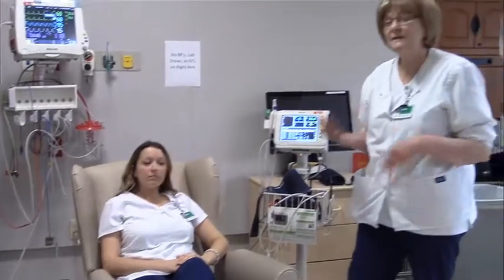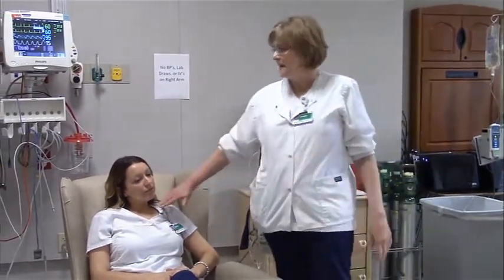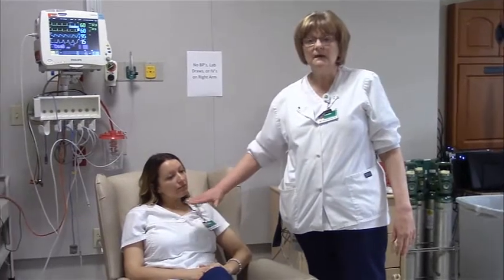If my patient has irregular breathing, what I want to do is count it for a full minute. If they're unresponsive, what I can do is lay my hand on their chest and count the rise and falls. I also want to pay attention to the rhythm. If there's pauses when I'm not taking in breaths, I need to know for how long. And you want to make sure you tell the nurse they had respirations of 15, but I had a 20-second pause or a 30-second pause. However it works out for that patient.